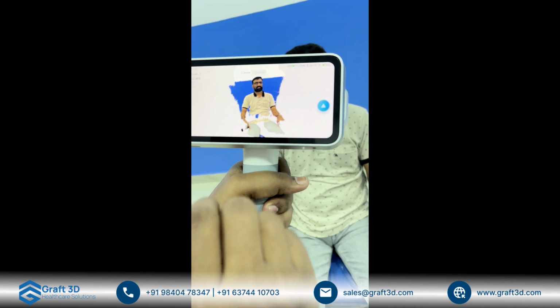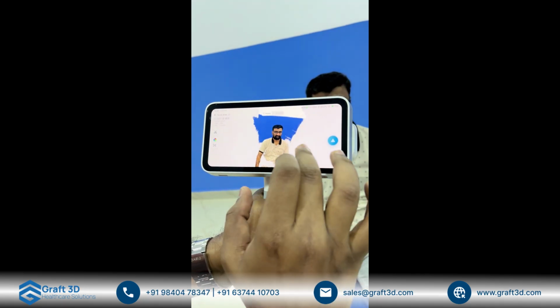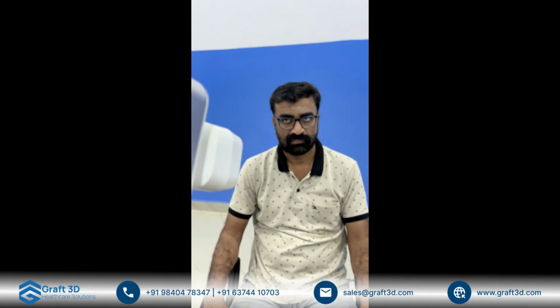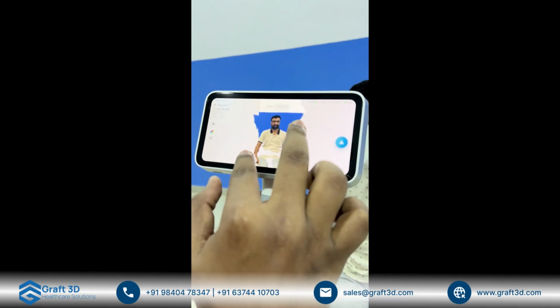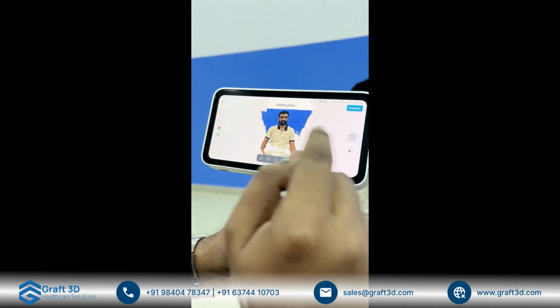So now you can see, this is how the scan data looks. This is still in the point cloud data format. Just take it on its face. This is the texture. You can see the texture quality as well with this particular scan data. Once we are good to go, then maybe we can do the modification. We can remove the unwanted parts. We have the editing tools over here. Different editing tools are there.